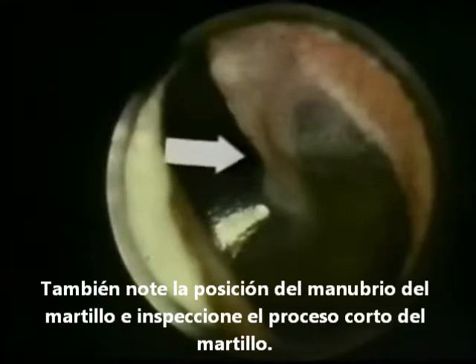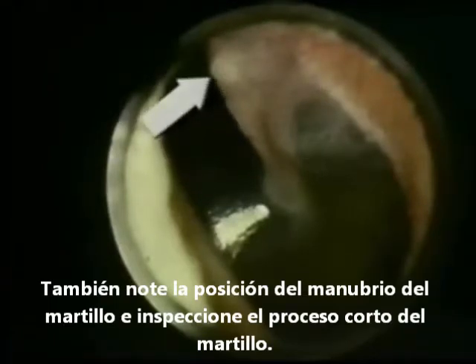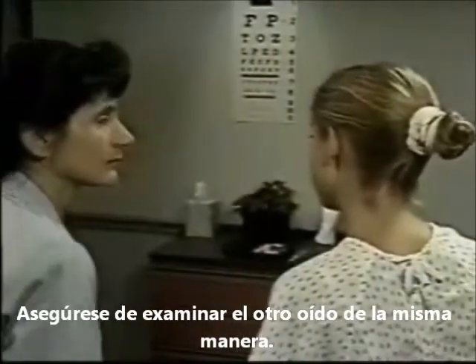Note the color and contour of the eardrum with its distinct cone of light. Normally, the drum is pearly gray. Also, note the position of the handle of the malleus and inspect the short process of the malleus. The handle of the malleus, with the umbo at its tip, crosses the drum obliquely from the cone of light upward toward the short process. Be sure to examine the other ear in the same manner.